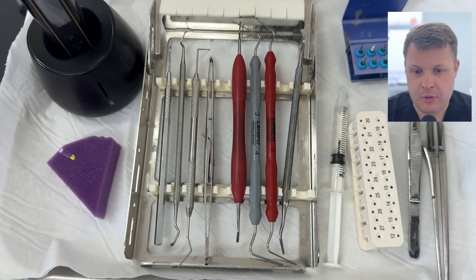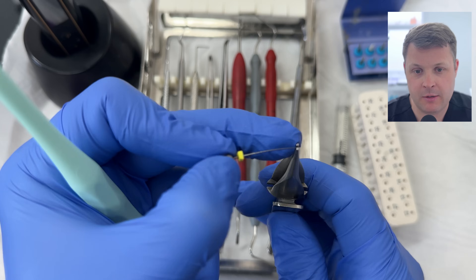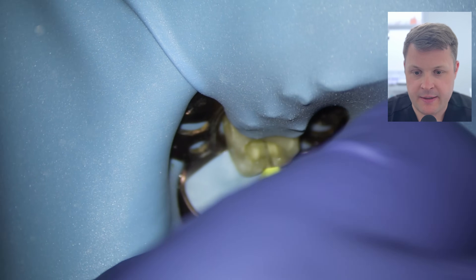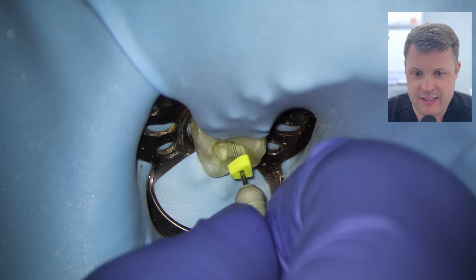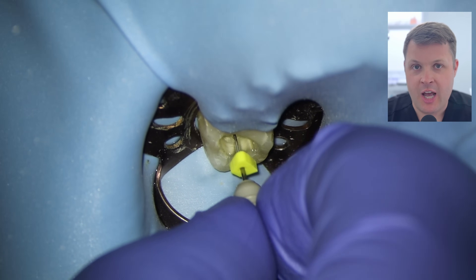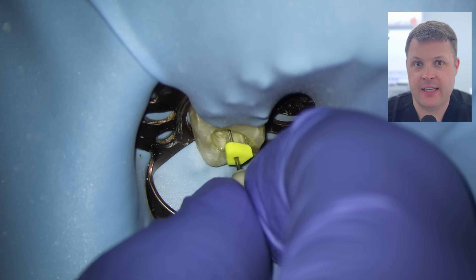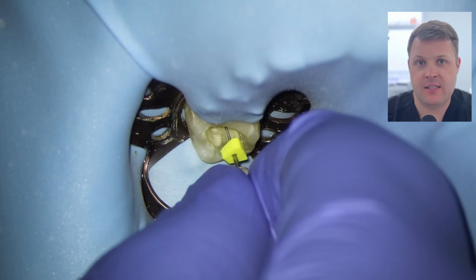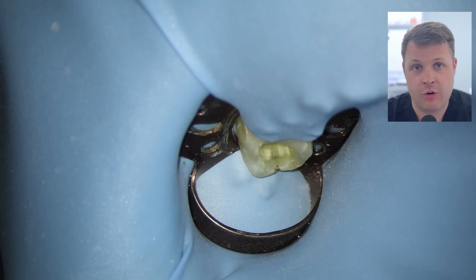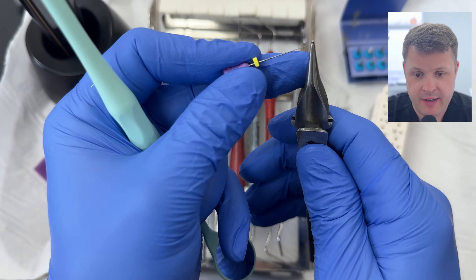Now I'm going to use a size 8 D-finder — same preparation: cut the stopper off, make a little bend at the end. Using a very very gentle watch-winding technique, I finally feel a kind of drop and a definitive catch — I've passed this sort of ledge. What I do now is use a pushing in-and-out technique to try and file out this catch, because at the moment I don't know if it's a ledge, a blockage, or a very deep apical split. I have reached past zero with this size 8 D-finder.